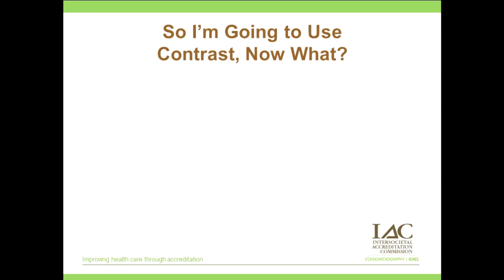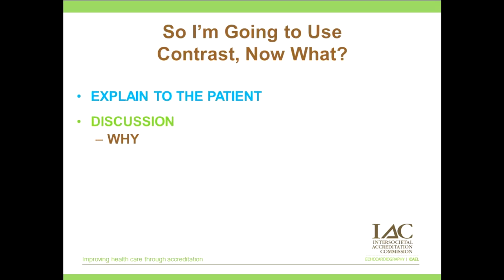Okay, so now you're scanning your patient and you decided you wanted to use contrast. So now what? Well, first, I like to explain to my patient why I needed contrast. This discussion will be why you need contrast, and I actually like to show them their echo images, and I explain to them what needs to be seen. If I haven't found any evidence in the patient chart or on the last patient's echo report, I'm going to talk to the patients and address the contraindications.